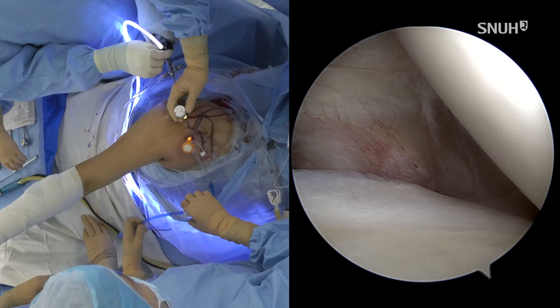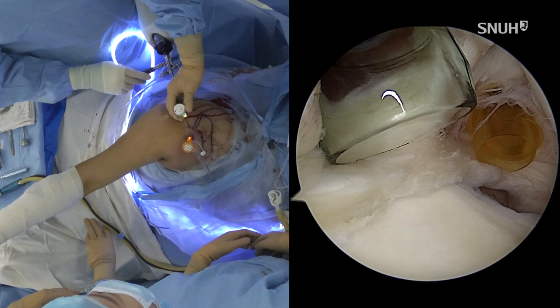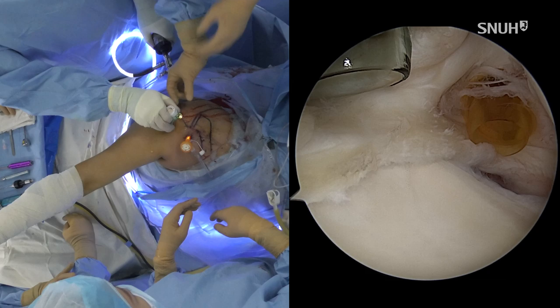But according to my paper, after several hundreds of cycling motions, the suture knot comes into the glenohumeral joint, and sometimes it causes abrasion arthritis, arthropathy. And also for the SLAP, definitely, in the position of abduction and external rotation, it does not cause impingement. So I like to use the knotless suture anchor. I will show you in this surgery the knotless suture anchor with Arthrex, 2.9 millimeters PushLock.